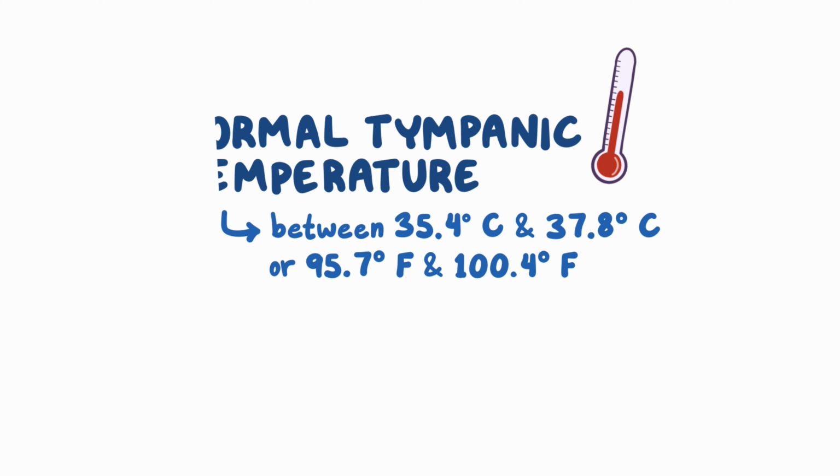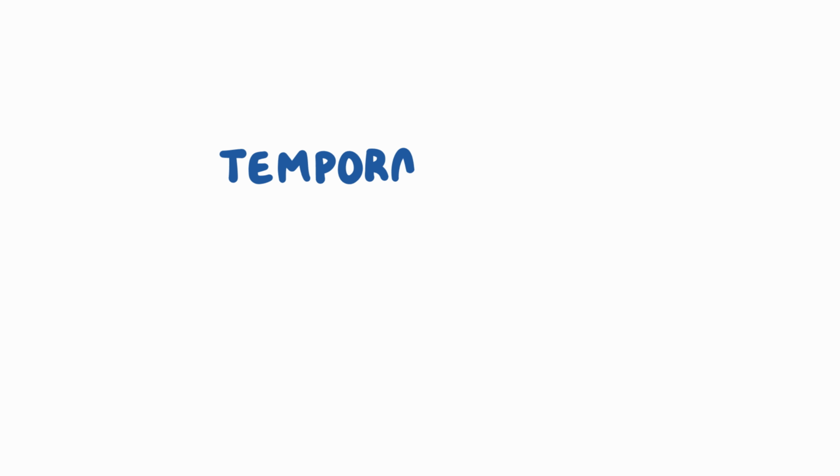Another choice is to take Fred's temporal artery temperature. Hold down the scan button a few centimeters away from the forehead.